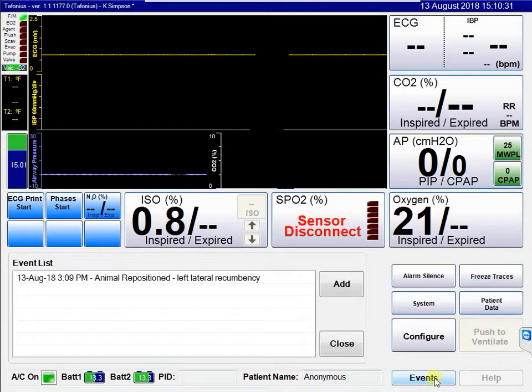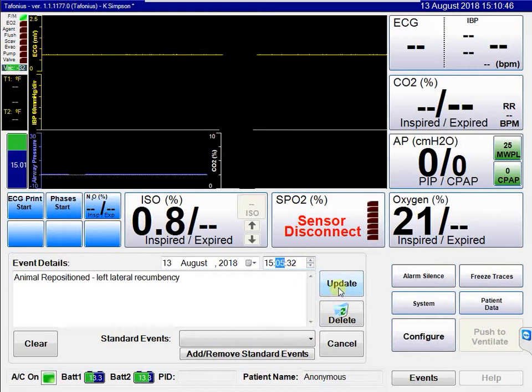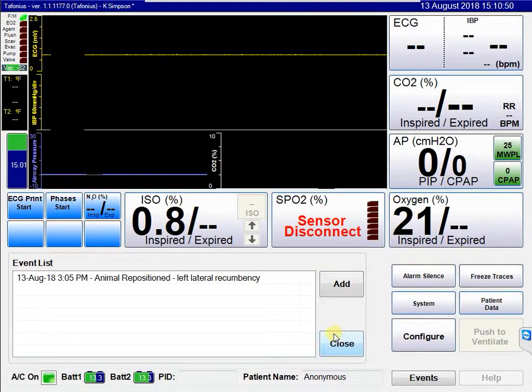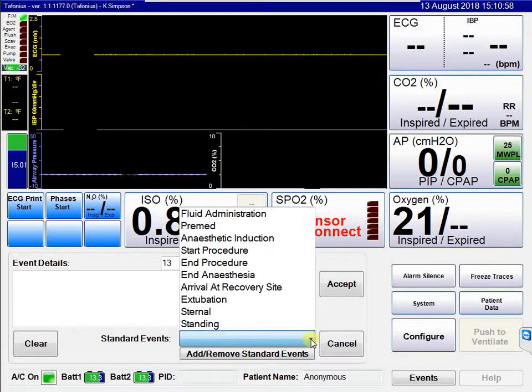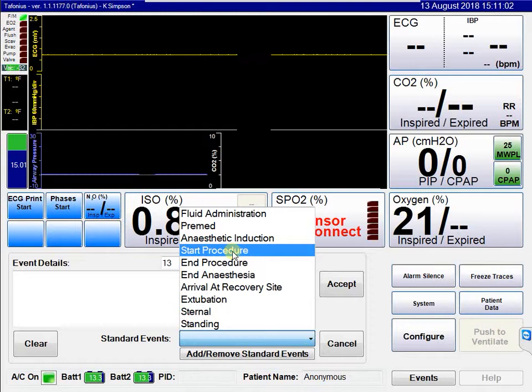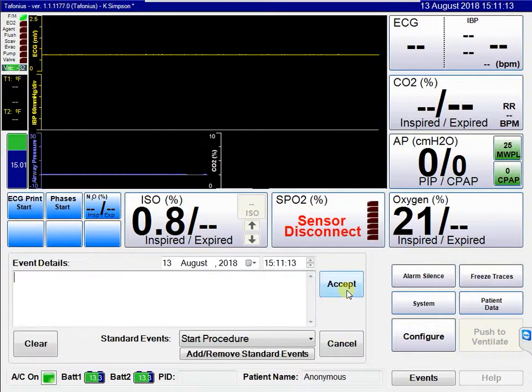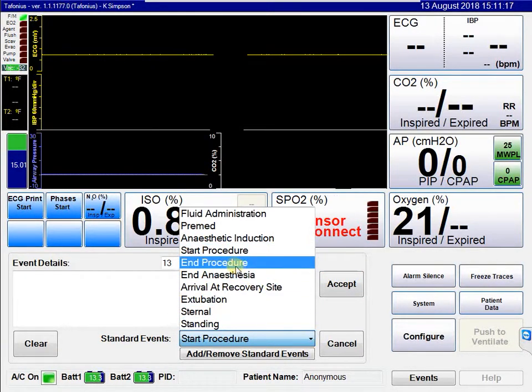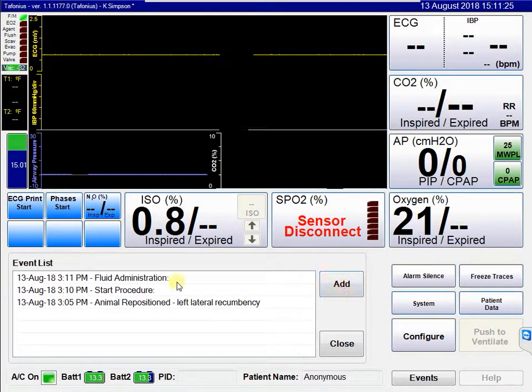You can come back into the events list and update an event — for example, changing the time if you entered it retrospectively, so it actually happened five minutes ago. You can also add another event. Standard events are available, such as start procedure and fluid administration. Accepting these adds them to the events list in order.